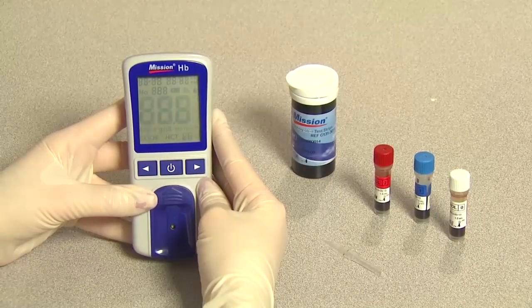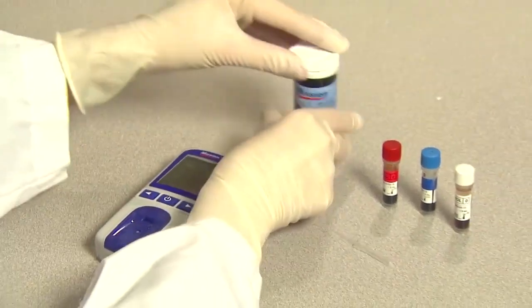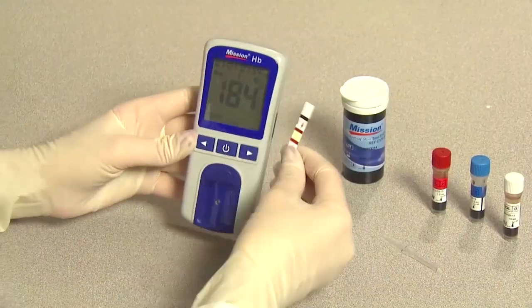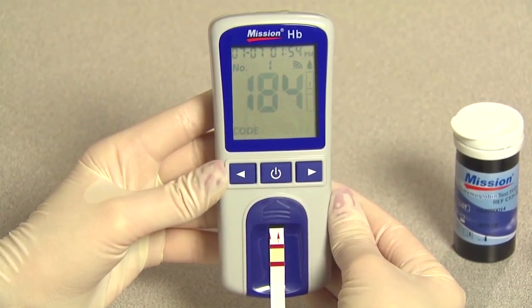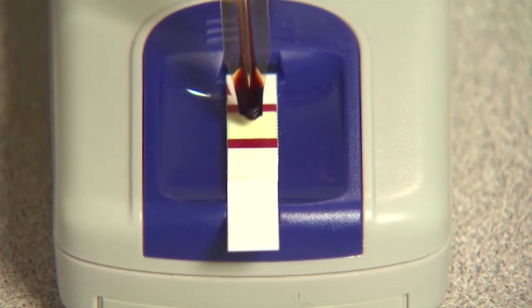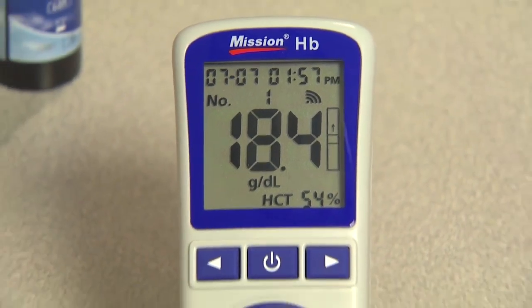Turn on the meter. Check that the code chip number on the LCD screen matches the inserted code chip. Wait for the meter to flash the test strip symbol. Insert the strip completely into the strip channel in the same direction as the arrows printed on the test strip. The blood drop symbol will flash when the meter is ready for the specimen to be applied. While the blood drop symbol is still flashing, use a capillary transfer tube to apply 10 microliters of the control solution to the center of the specimen application area. Three dashes will appear on the meter to show the test is in progress. Read the results on the screen after 15 seconds.